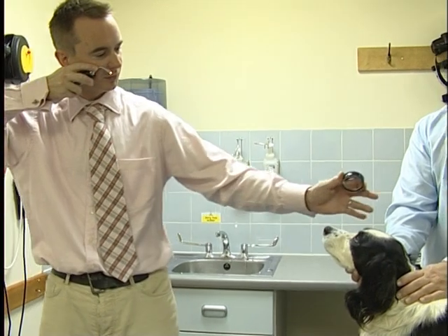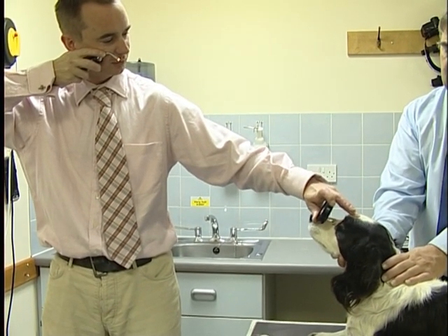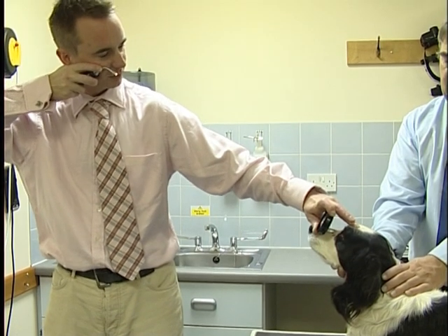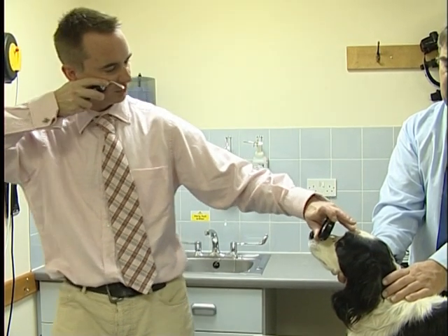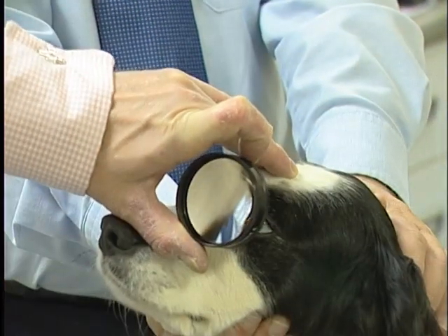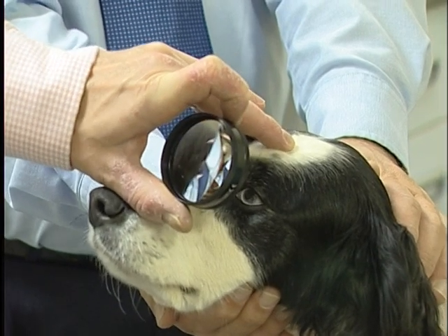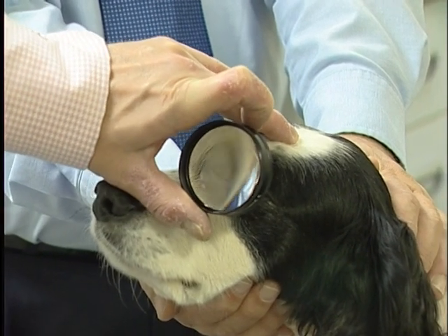and the hand lens is held at approximately arm's length away between the thumb and the forefinger, and approximately 5 to 10 centimetres away from the cornea and parallel with the surface. I'd recommend that, like a snooker bridge, the little finger is rested on the patient's head as far away from the lid margins as possible to help with stabilising the hand lens.